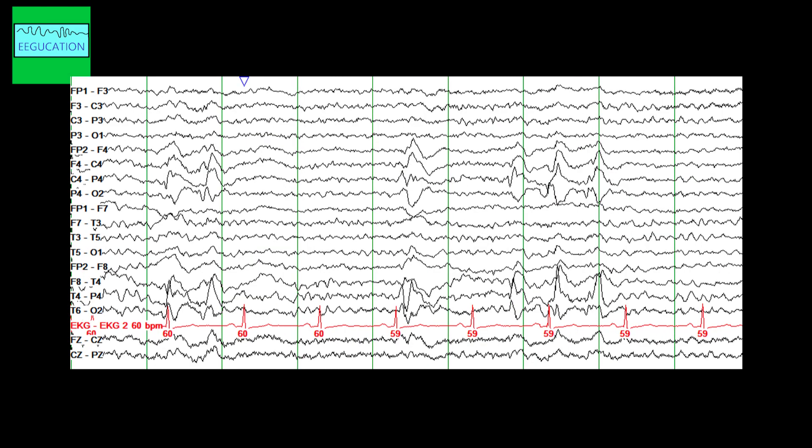This is another patient who presented with a seizure, and on EEG we find these lateralized areas of slowing. You see this area of slowing and there were sharp waves in the same distribution. The routine EEG helps to lateralize the seizure onset focus. On imaging, this particular patient probably had a meningioma, but it could be any structural abnormality. When you find lateralized findings — whether slowing or epileptiform discharges — you can consider a structural abnormality and correlate with neuroimaging.